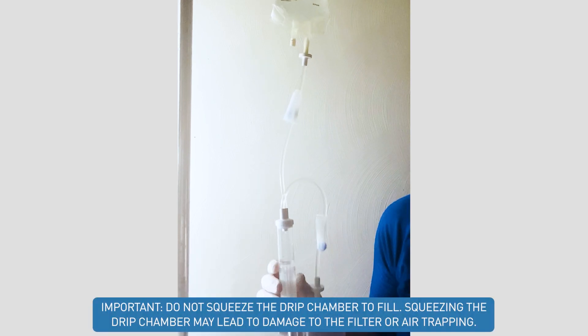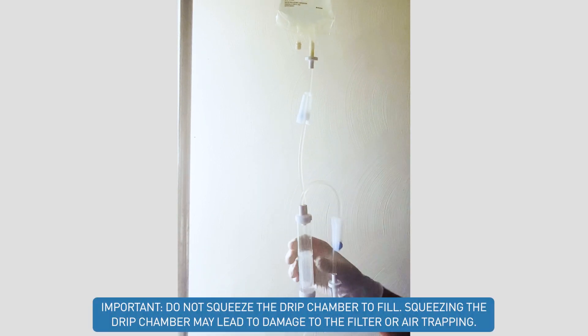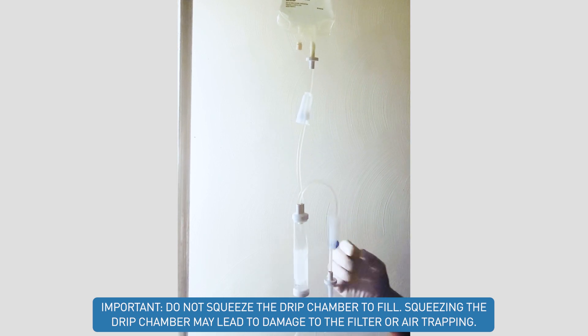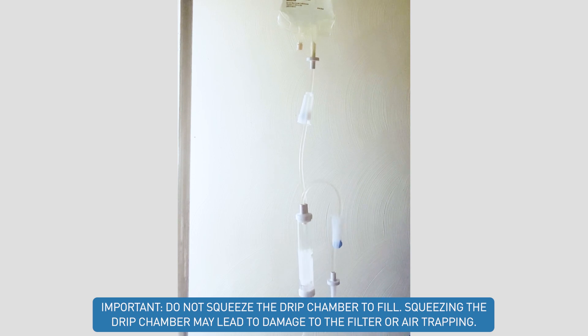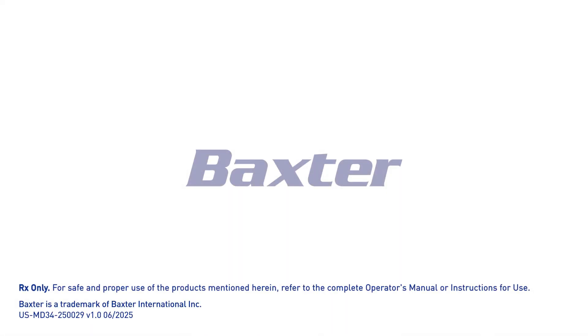We do not squeeze the drip chamber to fill. If you squeeze the drip chamber on this administration set, you can actually damage the filter or cause air trapping. Either one of these can lead to an under-infusion of your blood product or the actual drip chamber may crack.